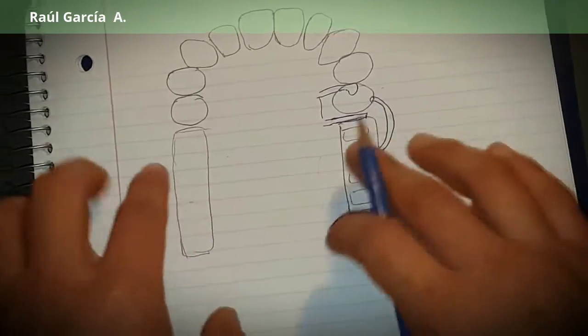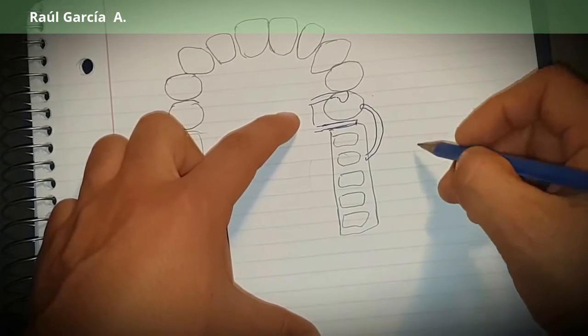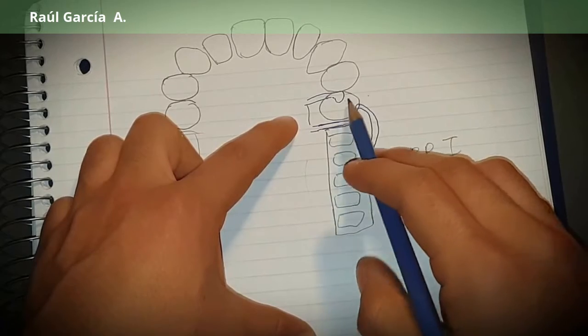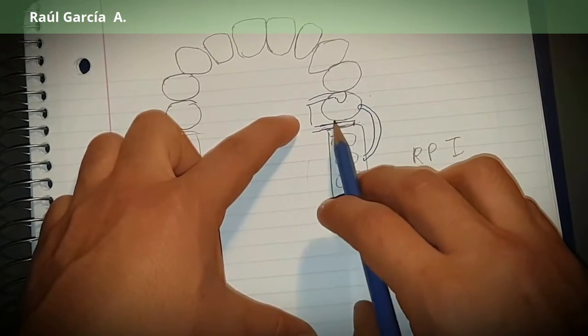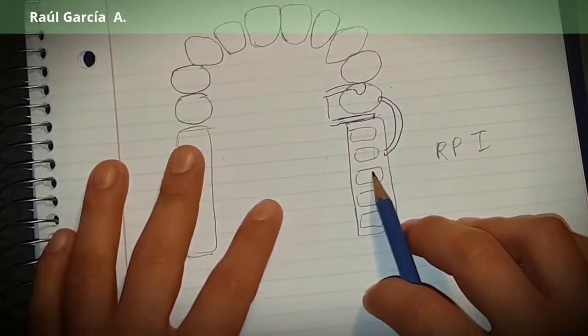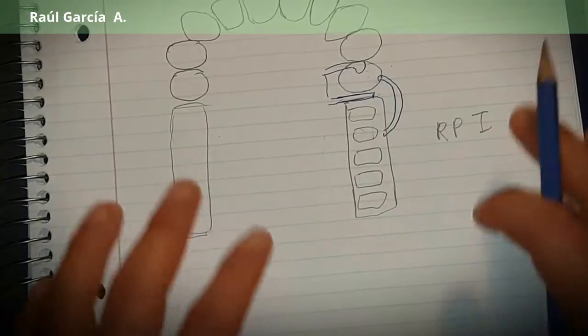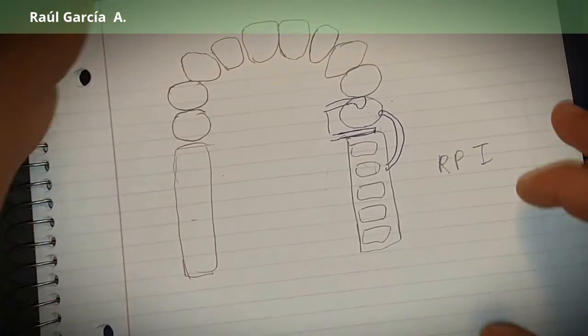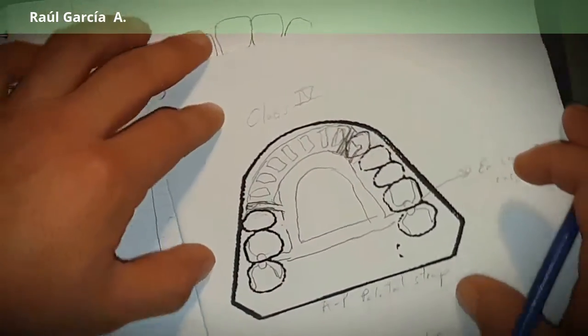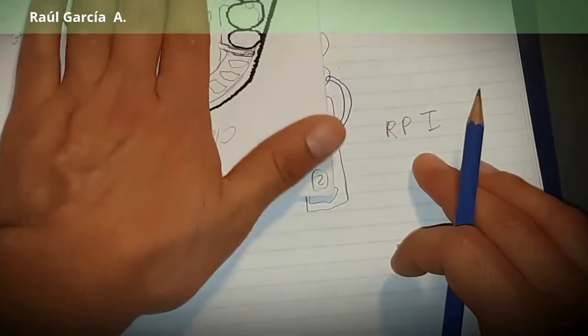In this case I'm choosing an RPI. So an RPI - the mesial rest, this is a guiding plane or the guide plate next to the saddle area, and the I-bar clasp. Why am I putting it like this? Because I want you to see it like this. This portion, I want you to see it like this so that you can draw it.